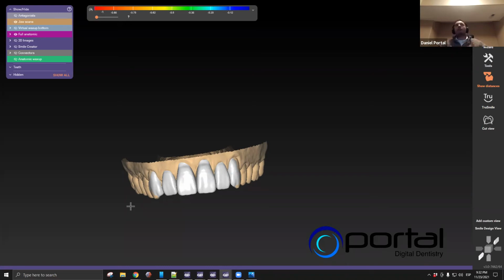Now, when I was at exocad, there were some discussions about making it a bit more interactive, where you can actually give feedback through the link. Right now, if I see an error, I'll have to text or email you back and let you know what changes to make. And so there were some discussions about possibly adding a way of putting notes on the design and arrows pointing to the things you wanted to point out to your designer to give feedback. So that's something that hopefully we'll get to see in future versions of the tool itself.